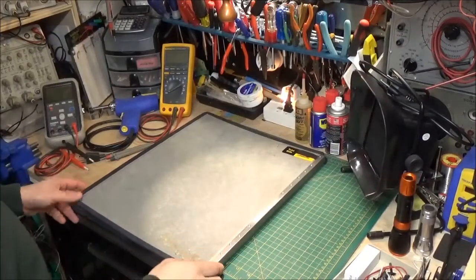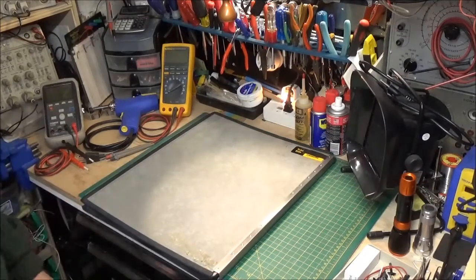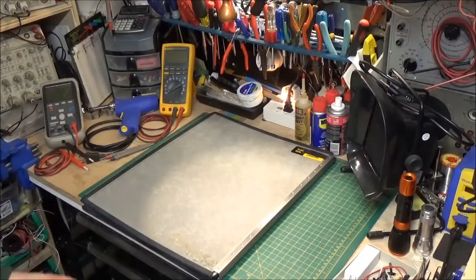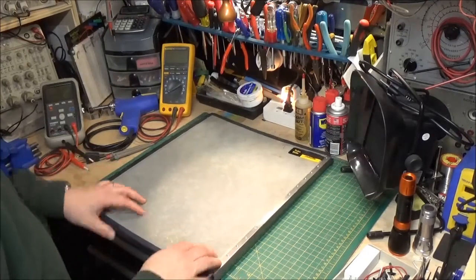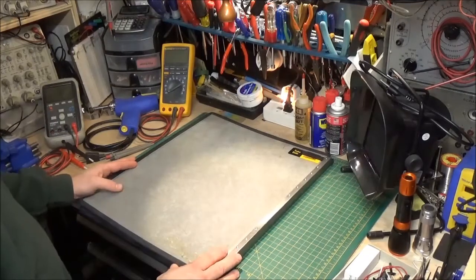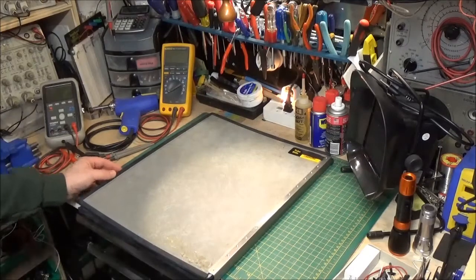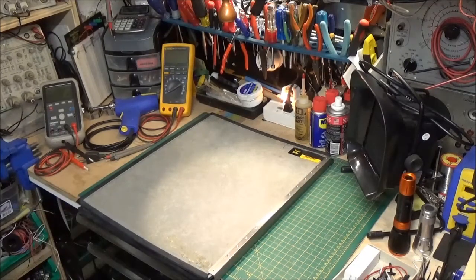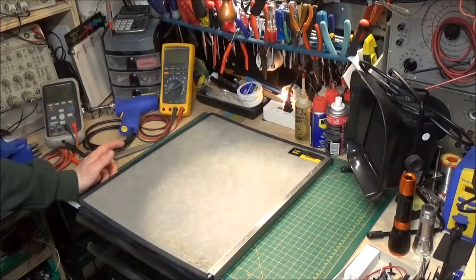Hi, today we're continuing our x-ray series. Some of you may find this interesting. We're going to talk about how an x-ray is taken and how you can record the x-ray. We talked about the x-ray tube, how it works in the generator, and we went out in the field and sat in on a calibration of an x-ray generator. Today we're going to learn what happens once the x-ray leaves the machine and goes through the patient — how do we pick it up?